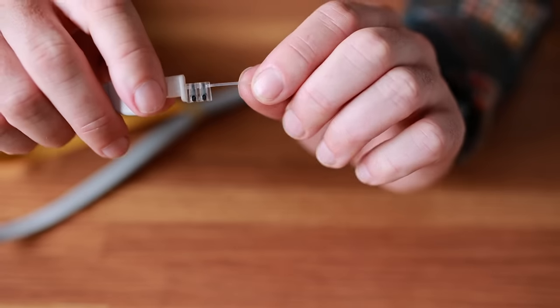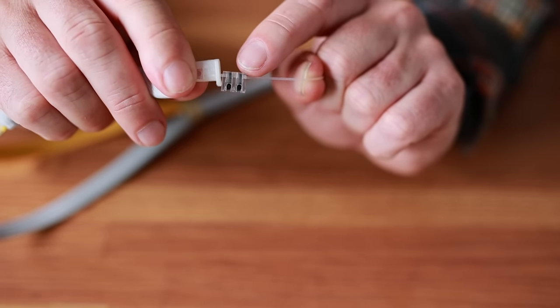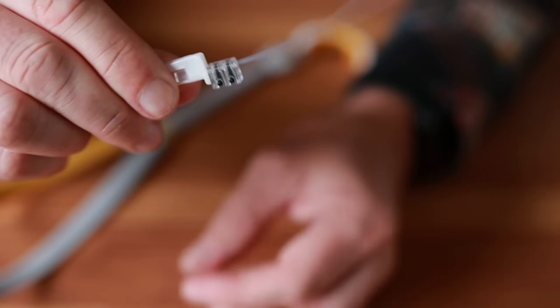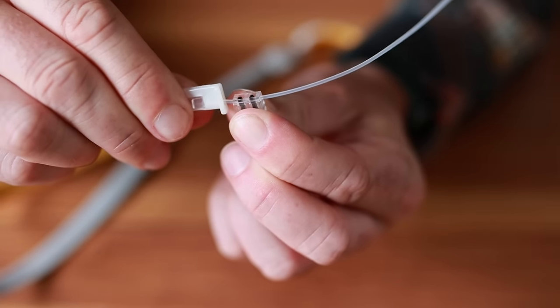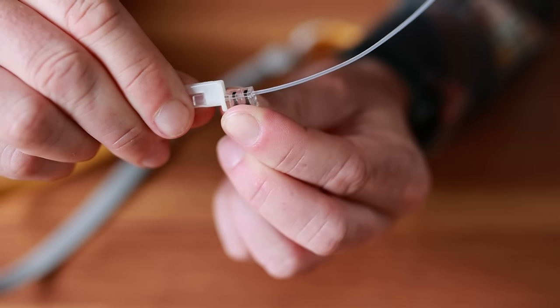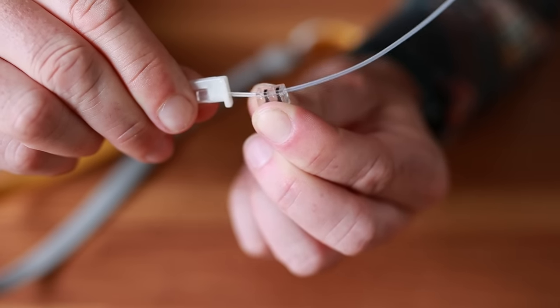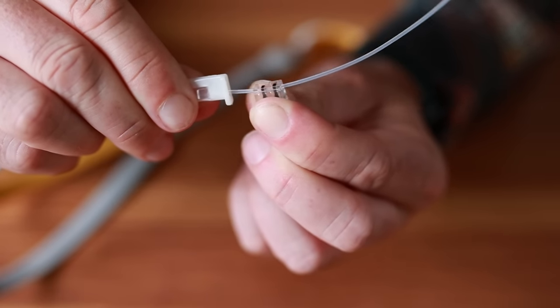Now, the magic is this tiny little locking mechanism here. When you pull this way, it's quite firm. But if it goes back the other way — no resistance, resistance, no resistance. That there is the magic. That little tiny section — how cool is that.